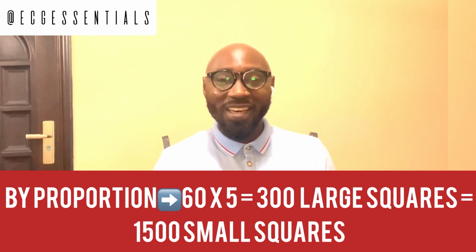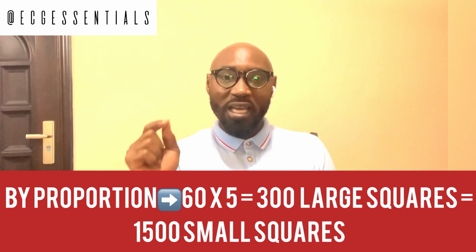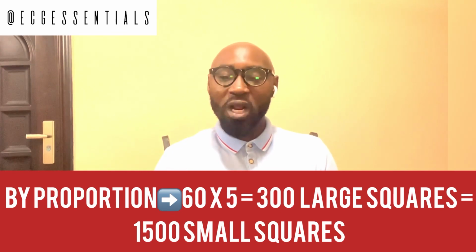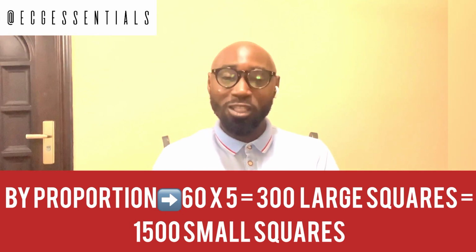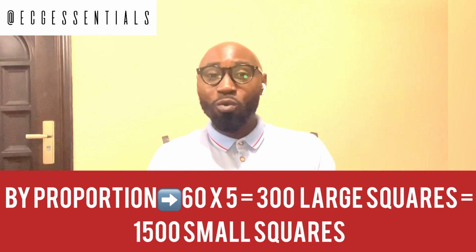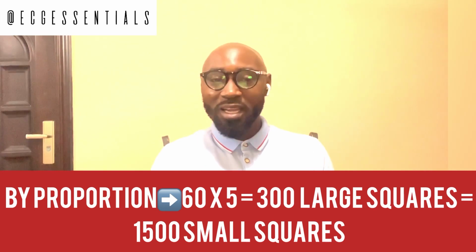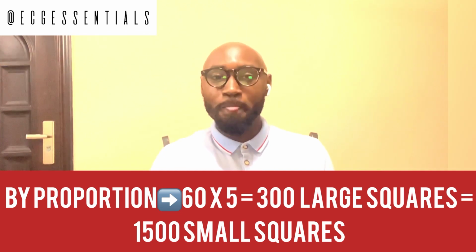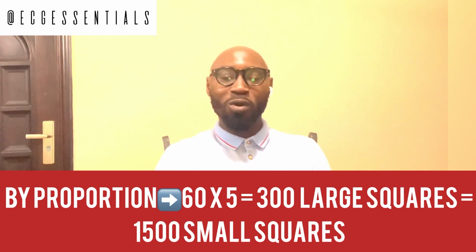So simply, the answer is that within a period of 60 seconds, we expect that 300 large boxes would have been printed on. Because again, 5 small boxes make up 1 large box, then if we wanted to use the small boxes instead of the large boxes, we use 1,500, that is 300 multiplied by the 5, and we divide the 1,500 by the number of small boxes.